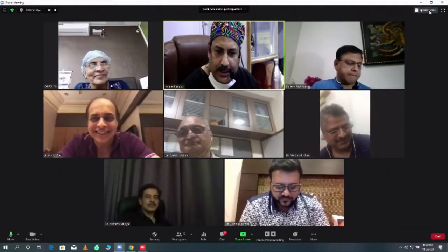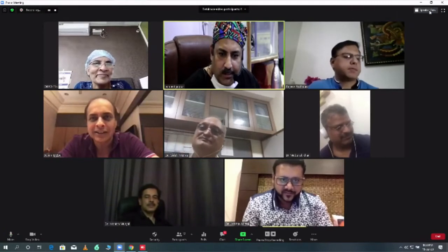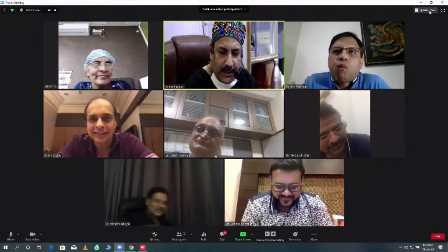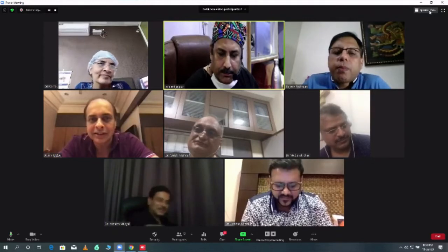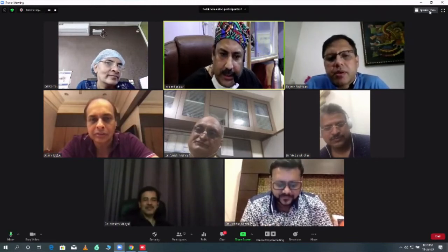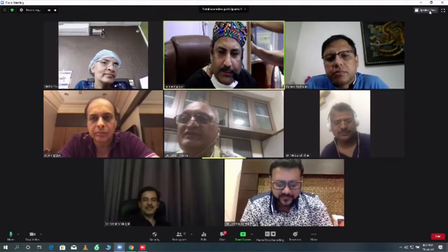So, Udbhav, any questions? You can direct them to Ashim. Sir, everything has been answered. We have a full stapes webinar now, two cases, everything completely covered. So I am keeping this time, every time if we get some variety. What we'll do like this, we'll keep the flap elevated and the overhang curetted so that it will not take time in between, like a filler.